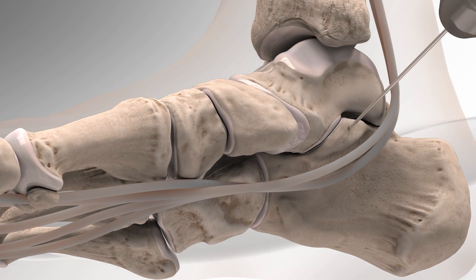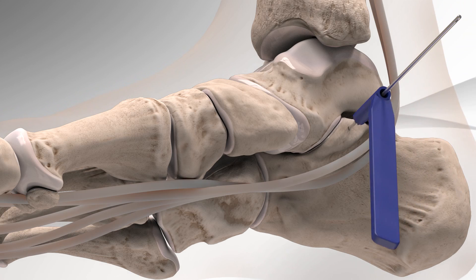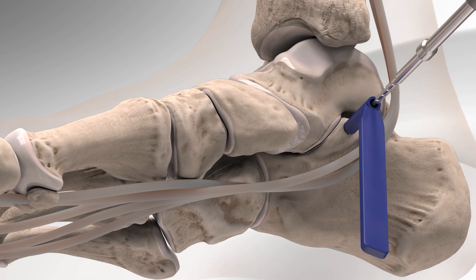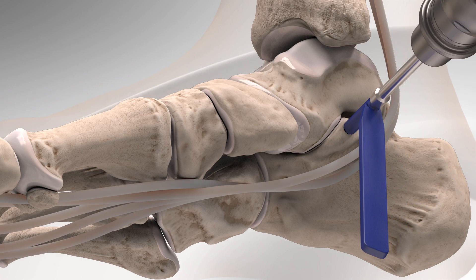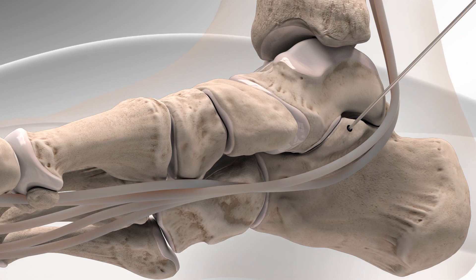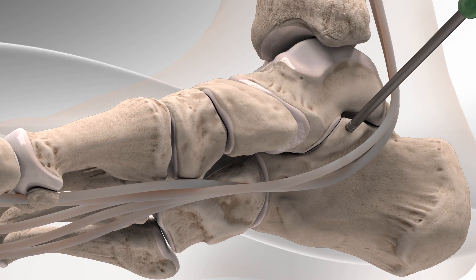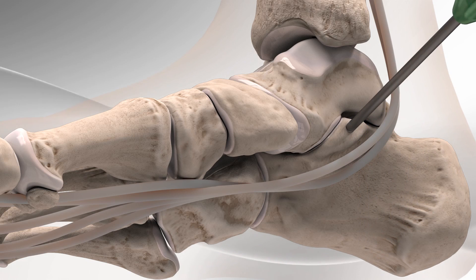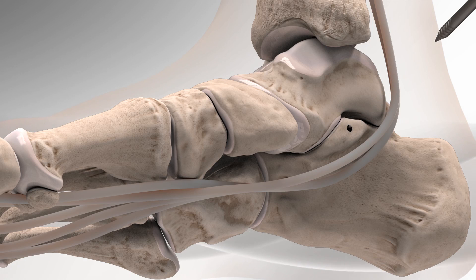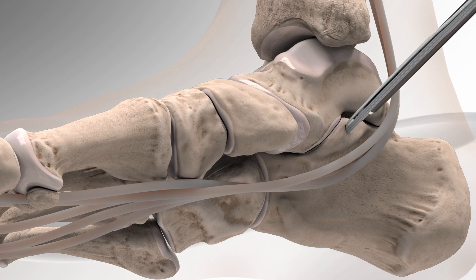Next, the surgeon will create a bone tunnel by drilling into the sustentaculum tali of the calcaneus using a guide wire and drill guide. The bone tunnel is made in the calcaneus to prepare for a swivel lock suture anchor loaded with fiber tape. The swivel lock anchor is then screwed into place.